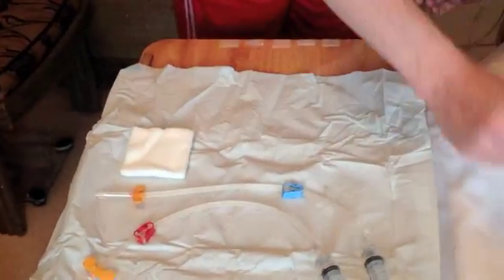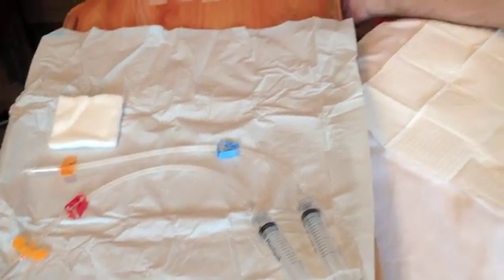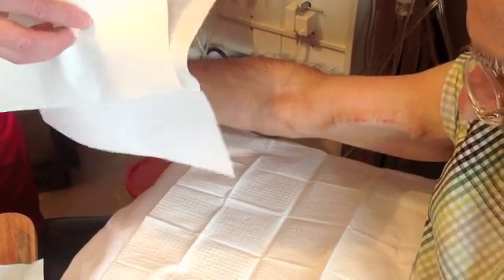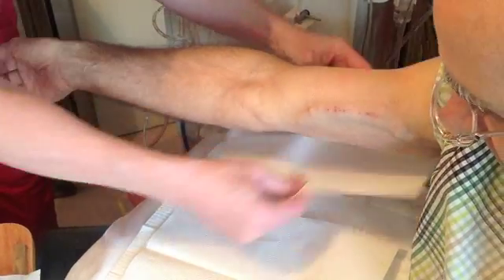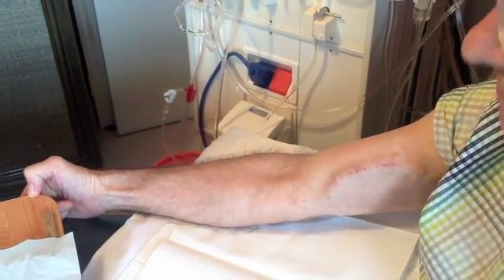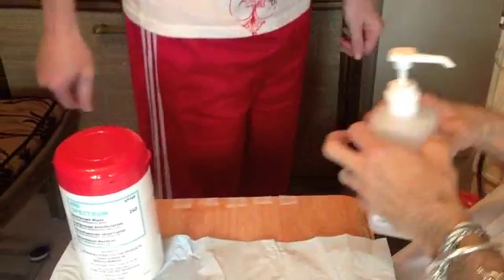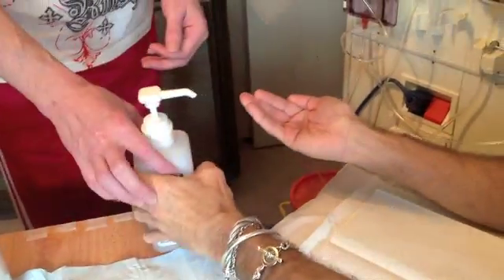I'm going to move that off there onto his pillow. That's to collect some blood. I actually usually put a couple of extras because it's quite uncomfortable for the patient to have their palm resting in blood. We usually just put those there. We're just recleaning our hands again — both of us do that.